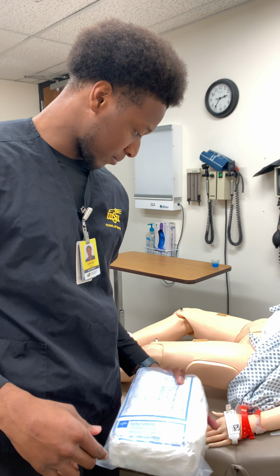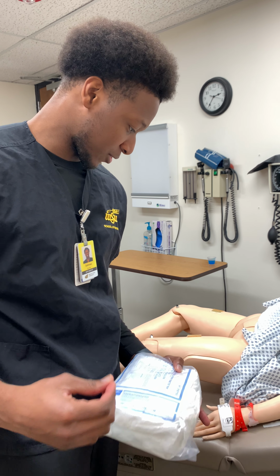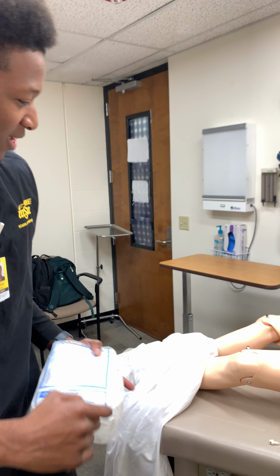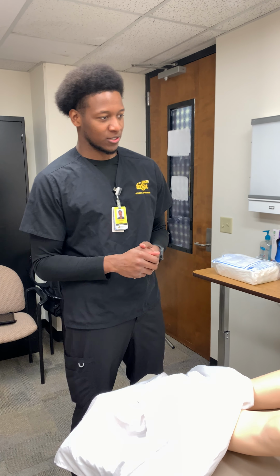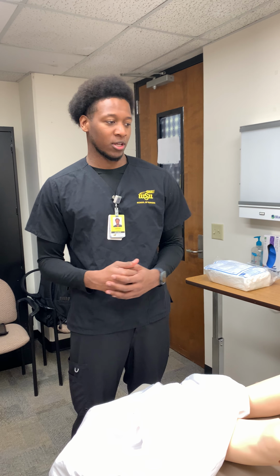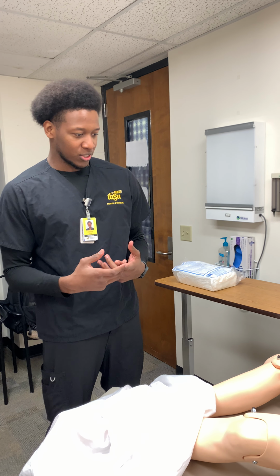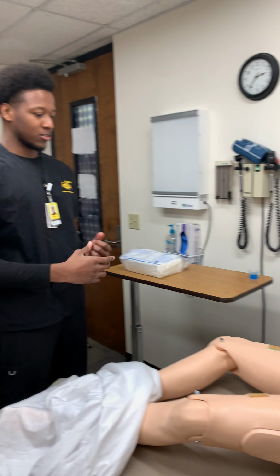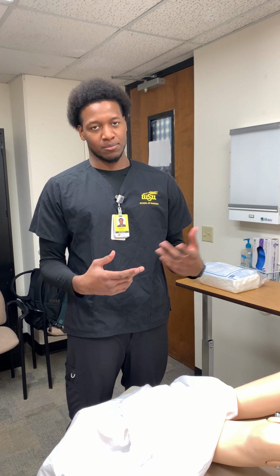Hello, so I see we have Robin Hood with a date of birth of September 13th, with no year, plus we have the MRN number. After I do that, I'll come over and explain to the patient what procedure I'll be moving forward with. In this case, it is a Foley catheter insertion, which is a device that we'll be inserting in the patient to relieve urine from their bladder to make it easier for the patient to use the restroom.